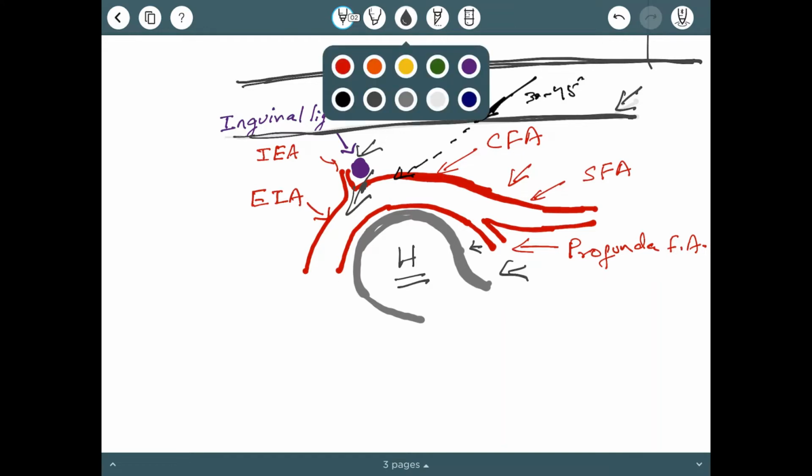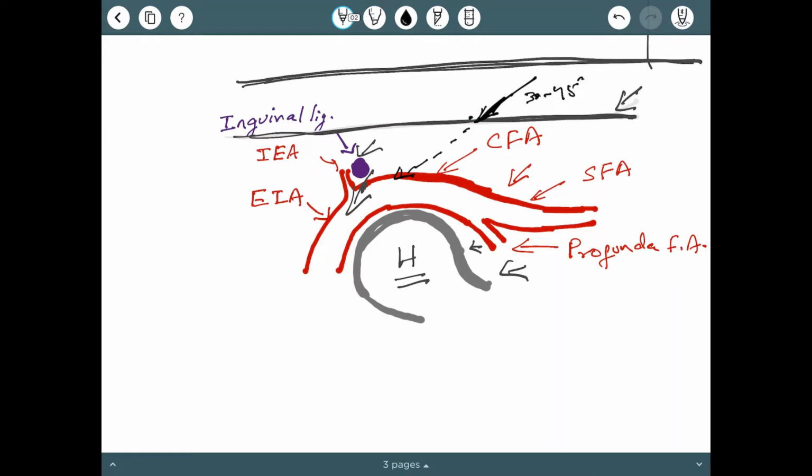If you use the same technique, and use the scalpel to measure the depth level of the inferior border of the head of the femur, and then you proceed at the same angle, imagine where you are puncturing. You are puncturing very deep.